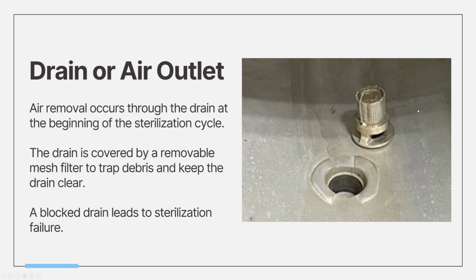So this thing here, for a lot of hospitals, it's simple enough to clean. We just remove it, but you have to make sure you're wearing oven mitts. And then we also use a compressed air gun on it to spray out any debris. Maybe some paper sometimes gets stuck in there.